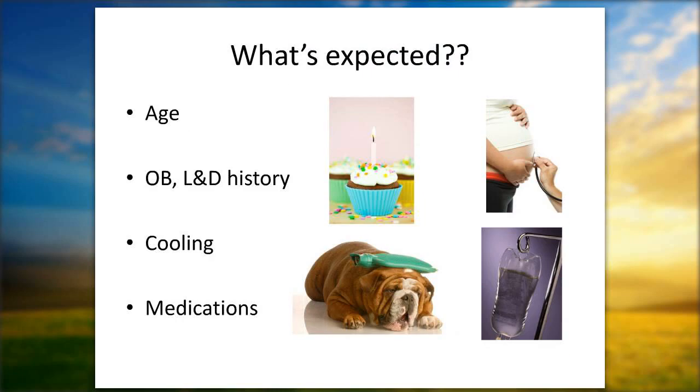What I like to do when I'm first teaching nurses how to interpret aEEG is to always think, number 1, of that baby's story, because that's going to help inform you about what you expect to see. So we should always go into looking at our aEEGs thinking about what we expect or intend to learn from this tracing. And if you're the physician, why did you order it, and why are you looking at it now? I think it's always a good idea to have those things in mind.